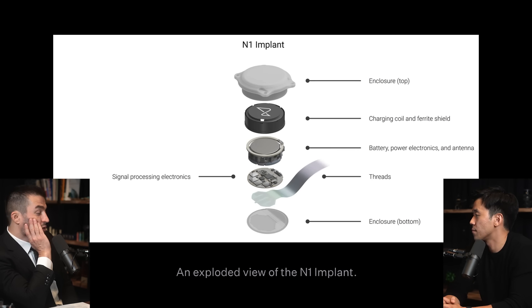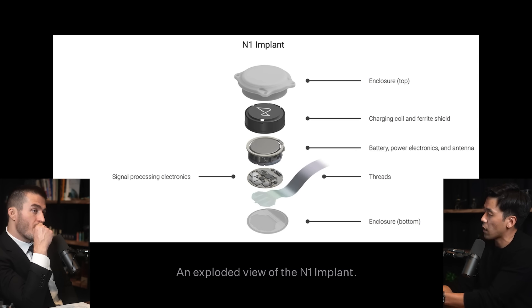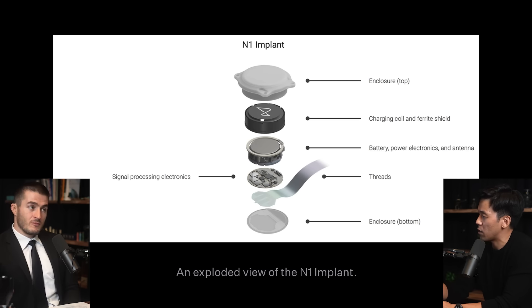So maybe to ask about the charging. There's an external charging device. The second part of the implant — the threads — the last three to five millimeters are the ones actually penetrating the cortex. The rest of the volume is actually mostly occupied by the battery — a rechargeable battery. And it's about the size of a quarter.